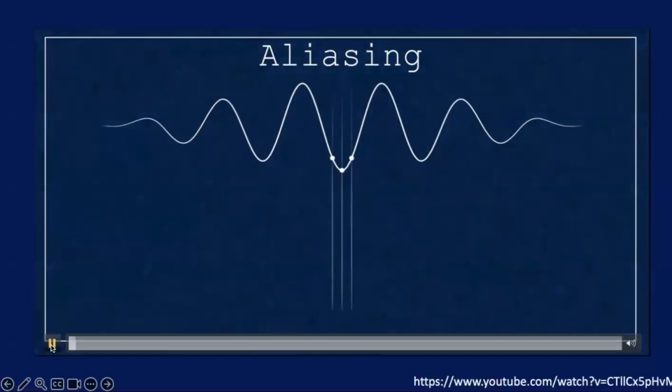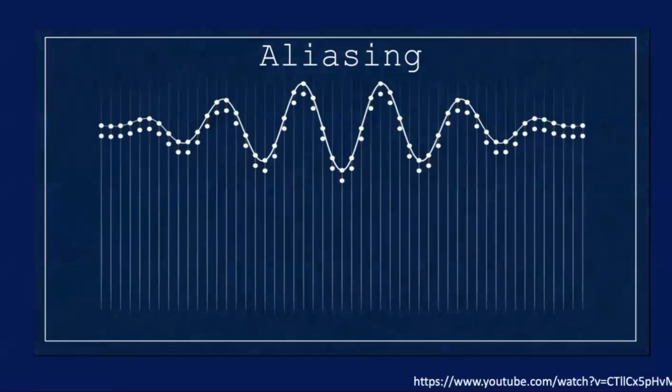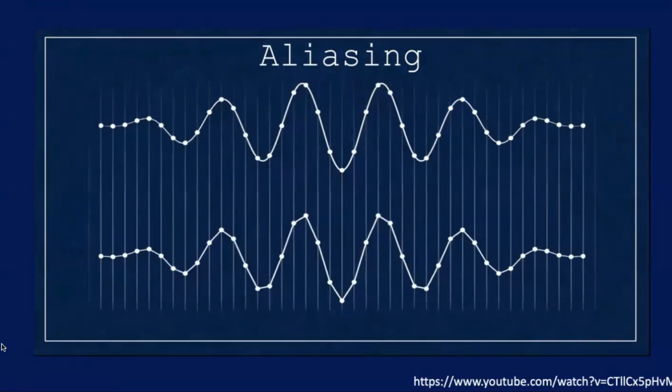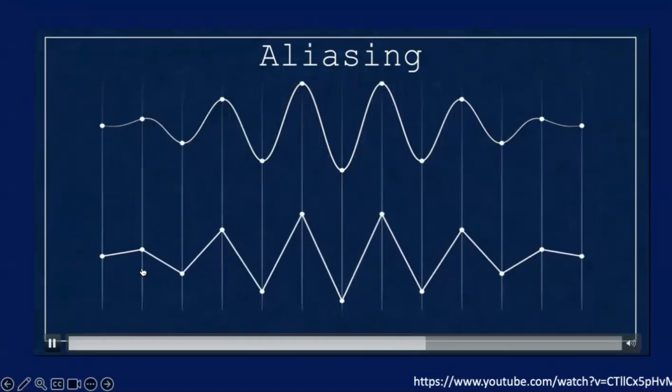So imagine this is the frame rate sampling for this signal, and then they start to decrease the sampling rate. This is the same sampling, then they start to decrease it. The original is above. You start to see the change in the waves here. Up to a limit, it is acceptable.